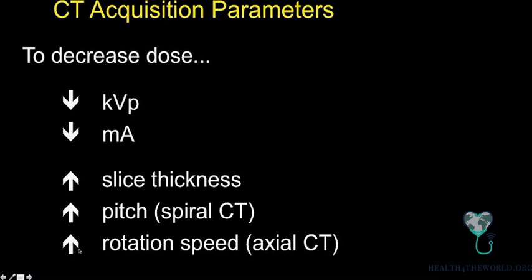Perhaps this is the most intimidating for people because you have to dip into your physics knowledge. I would say it's really not that big of a deal. You talk it over with your technologist, you talk with the manufacturer to help make some prudent decreases in these things, increases in these things, do it a little bit at a time, and you will get your doses down.